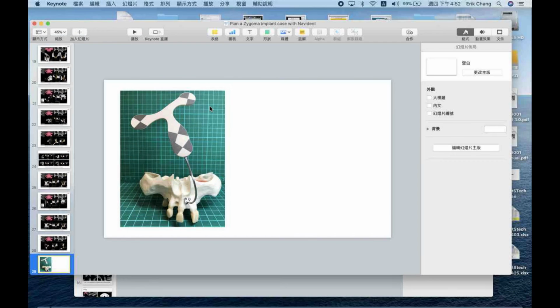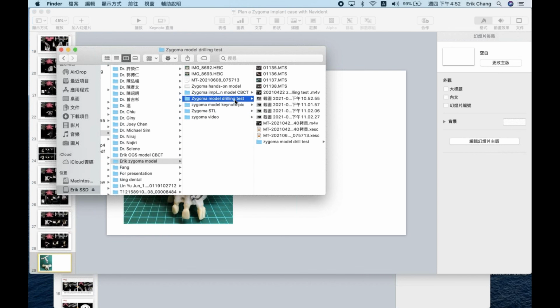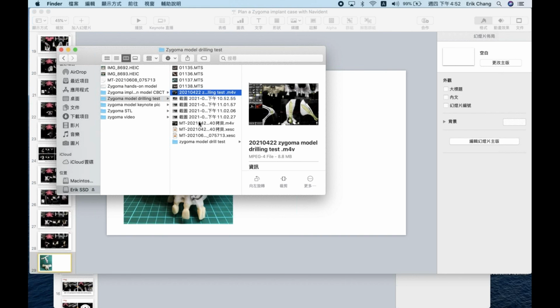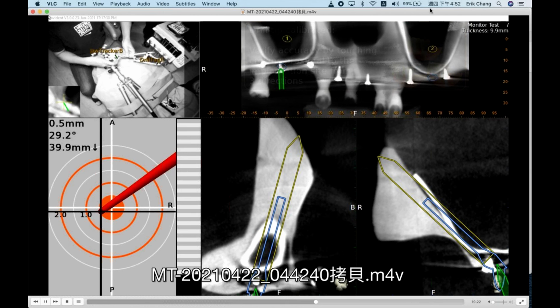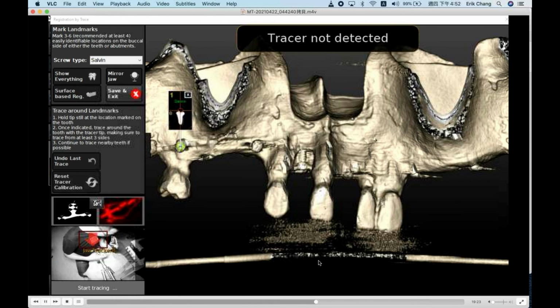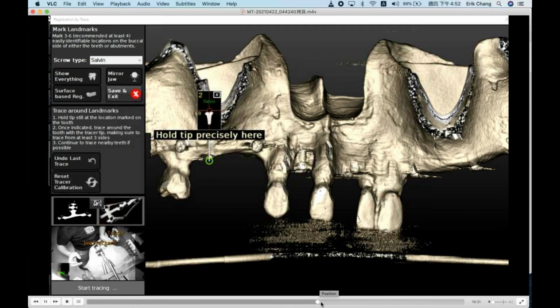Then after implant number 1, I will go to implant number 2 and follow the same steps again: increasing length, adding the 45-degree abutment, and tilting the implant, then checking from the 3D view. So basically, this is what I do right now in Taiwan. Then you place the jaw tracker, the bone jaw tracker. Yeah.